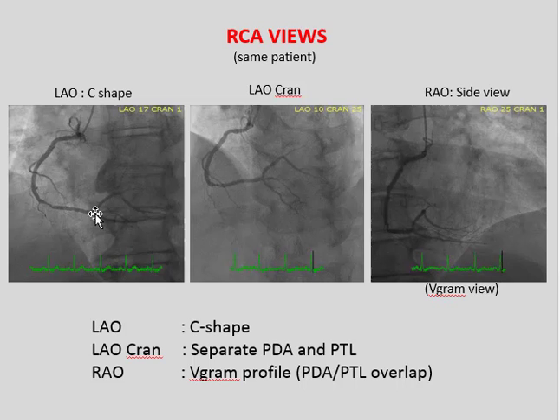And that is what's called the traditional LAO view with a C shape. Towards the bottom, the inferior aspect, the vessel bifurcates into the posterolateral, going upwards here, and downwards, the posterior descending. Downwards D, descending D. The posterolateral actually tends to go into the heart rather than just up and across. To me, they all look like C's of varying shape, but this is what people refer to as the traditional C shape.